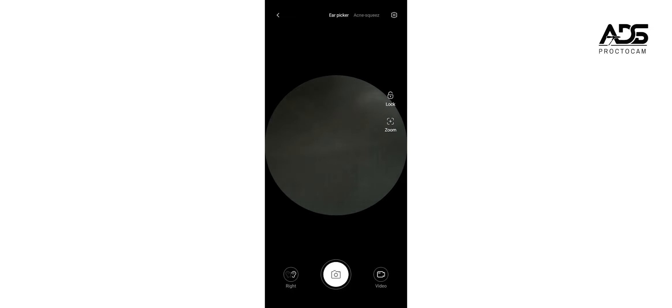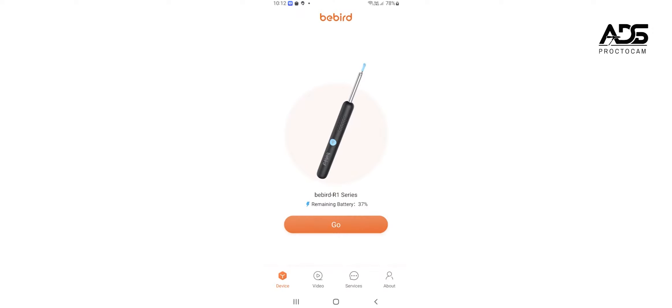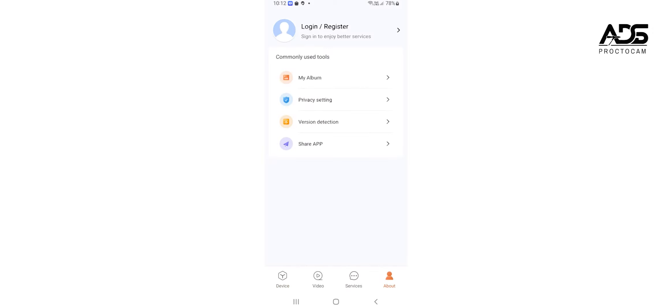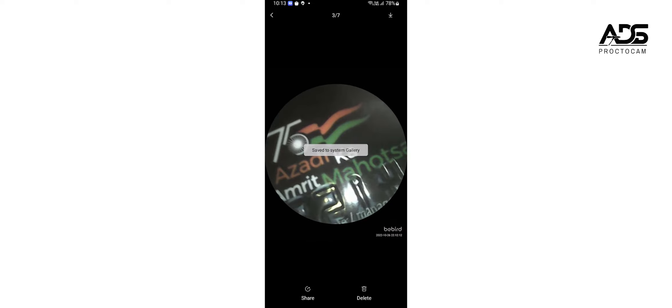Once you have used the application to record images and videos, go to the About tab and click My Album. There you will find all the images and videos you have recorded recently.